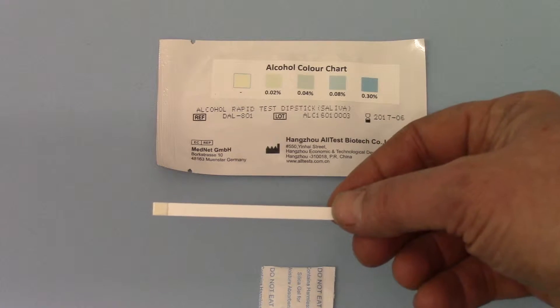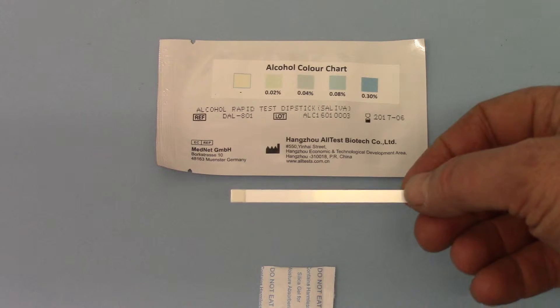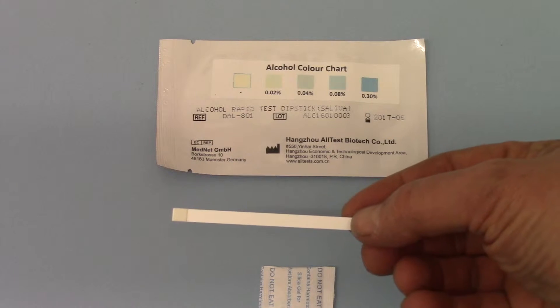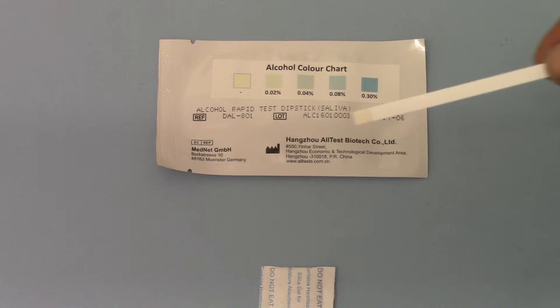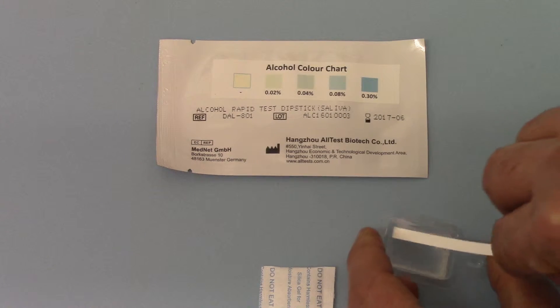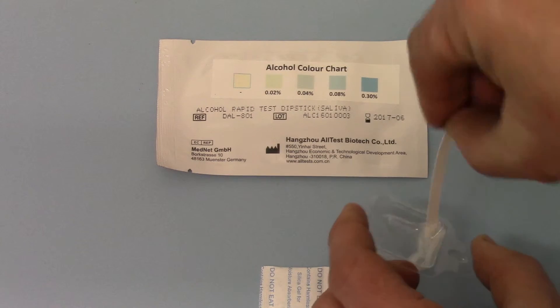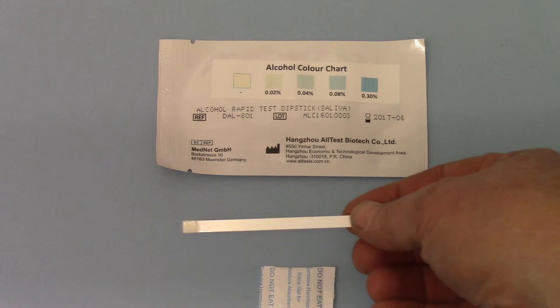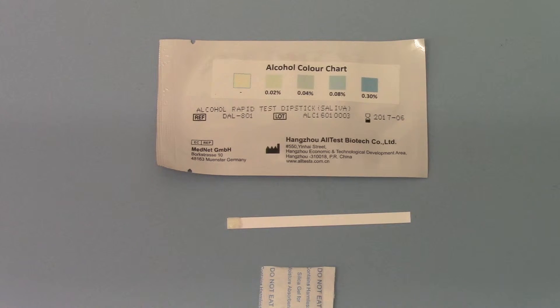To run one of these tests, all you need in addition to what is supplied is a watch or clock to start measuring your 2-minute read time. Take the test pad and simply immerse it into your saliva sample, remove when saturated, and lay flat on a non-absorbent surface.